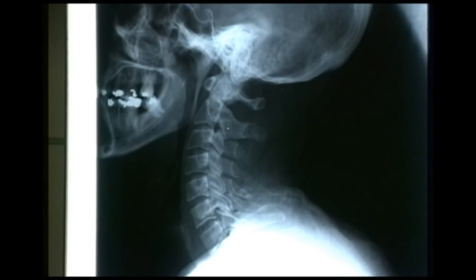When we receive a patient with significant trauma, having gone through the ABC of airway, breathing and circulation, we take the normal first series of trauma x-rays: cervical spine lateral view, chest radiograph, and pelvic x-ray. The lateral cervical spine view shown here is actually incomplete — counting down through C1 to C7 we can see to C7's lower border but not T1, so we don't know if there might be an injury there. We must have a high index of suspicion for cervical spine trauma because we risk paralysis if we handle these patients wrongly.